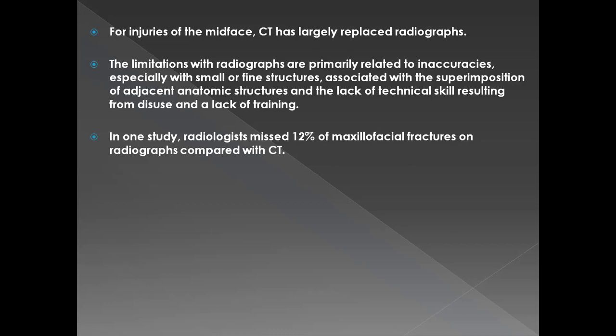They actually did one study in which they compared CT with plain X-rays, and they found that radiologists missed 12% of fractures on radiographs as compared with CT. So they were more capable of picking up fractures on CT as compared to plain X-rays, and 12% is quite a huge number.